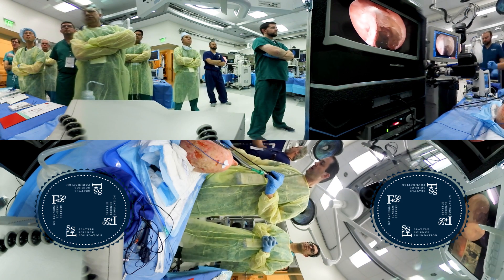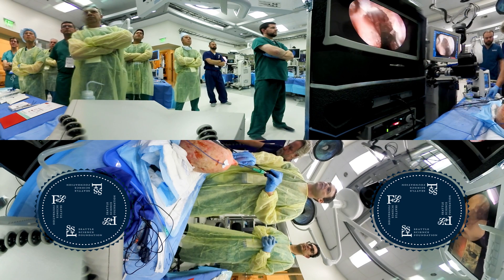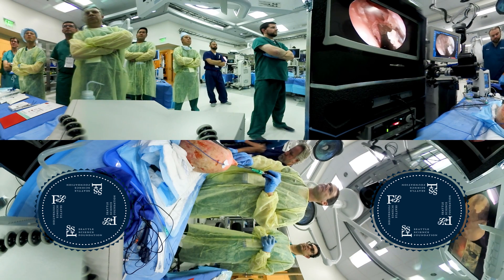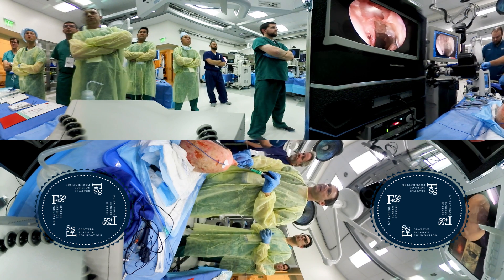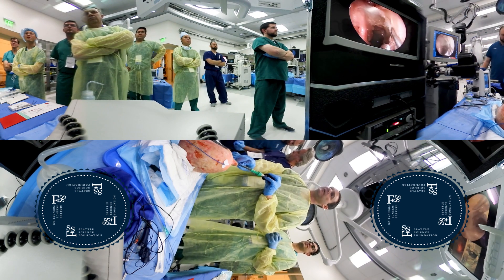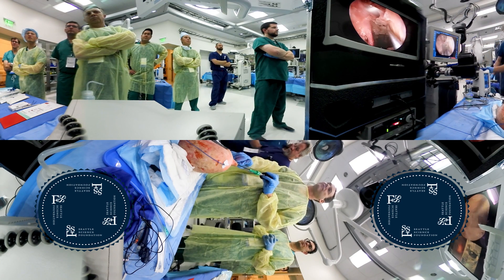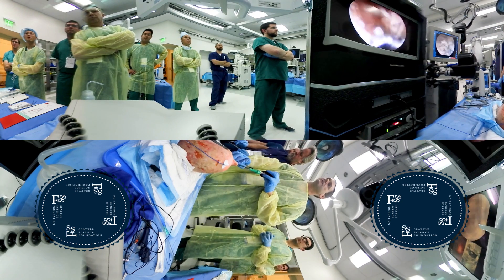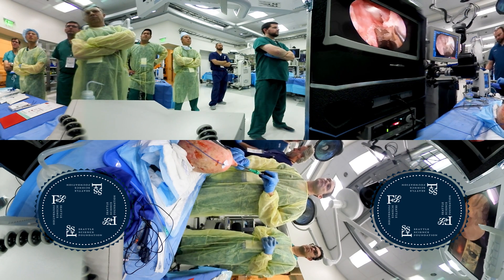Once you get this exposed, you ought to be able to get in with a curette or just a freer. It's always interesting — when you want to go through the lamina, it's really thick; when you don't want to go through it, it's paper thin. So sometimes with these orbit decompressions you just have to keep palpating until you find the nice soft part of the lamina. I'm going to fracture this out, and you would want to take out all these little pieces as you go along. The key is to try to avoid going through the periorbit at the beginning.